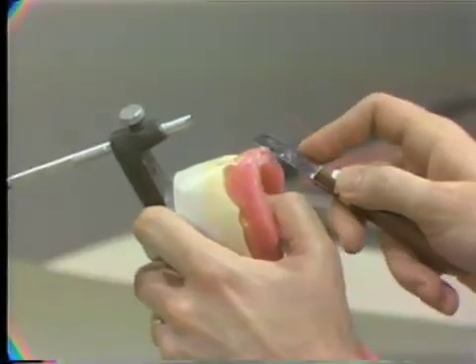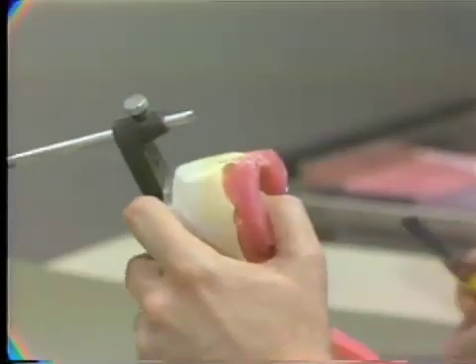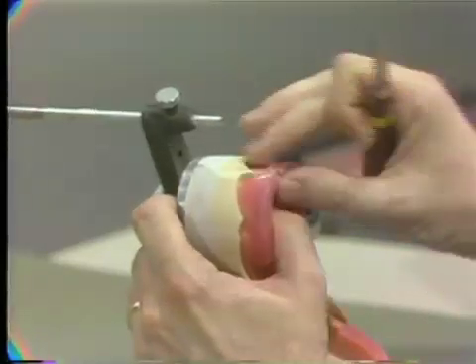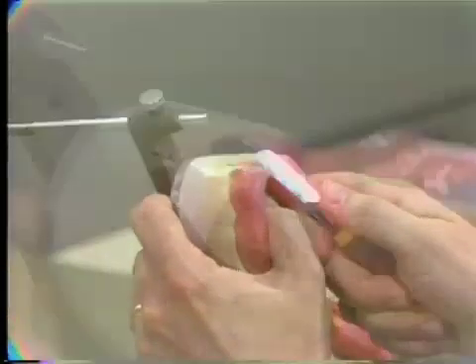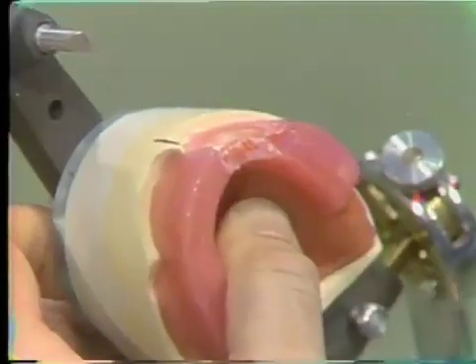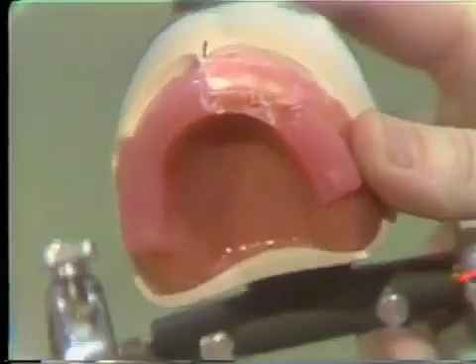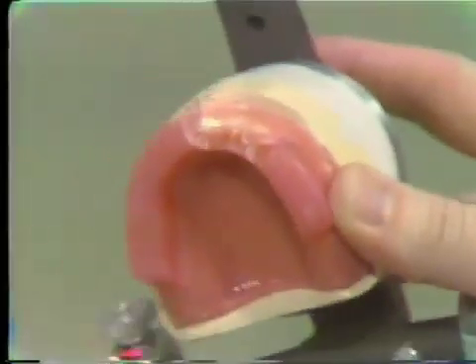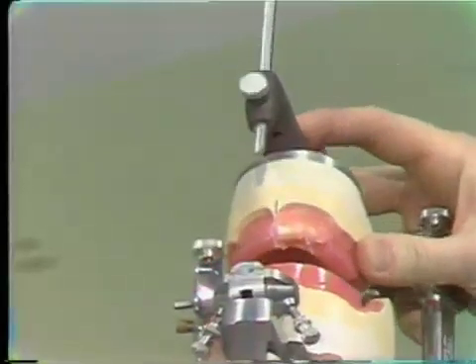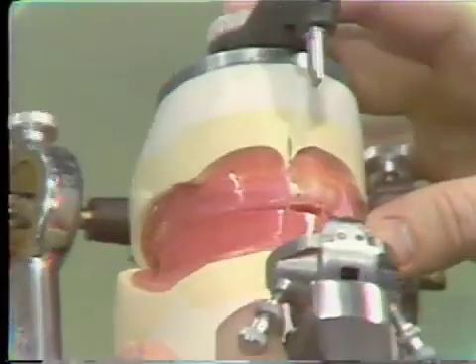Now in this first exercise we are only setting the anterior 12 teeth. That means 3 on the side where I'm working now, so I'm only going to remove the rim back to the area of the future bicuspid. And the reason for this should become pretty obvious, and that is with the pin out of place, we want to maintain the vertical, so we leave part of the rim in the posterior area, and then when the articulator is closed down and the pin is not in place, we still have our vertical maintained, you see.